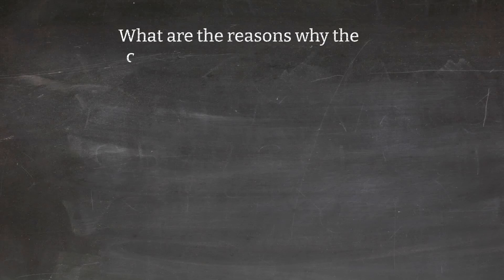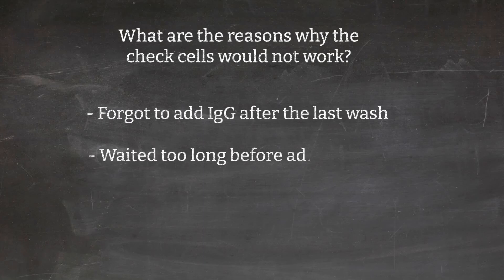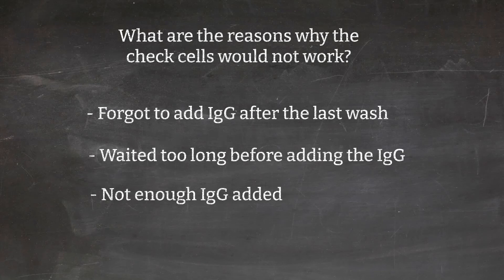Do you know what are the reasons that the check cell would not work? Let's go over it. One: forgot to add IgG after the last wash. Two: waited too long before adding the IgG after the last wash. Three: not enough IgG was added — maybe you added one drop instead of two. Four: not enough washing.